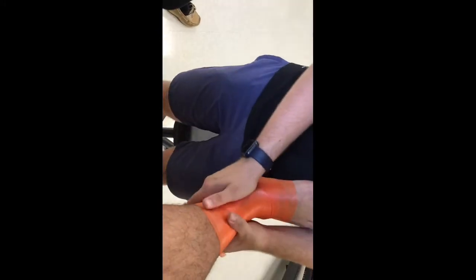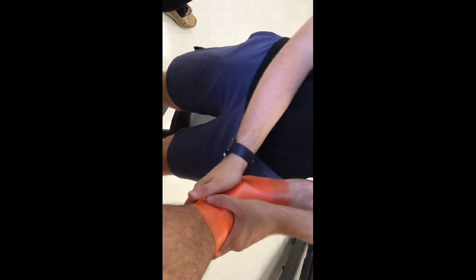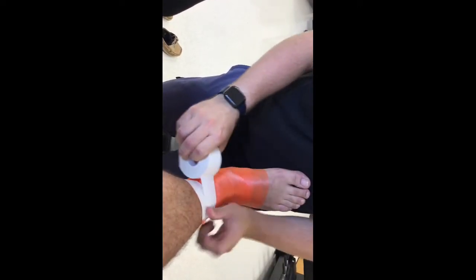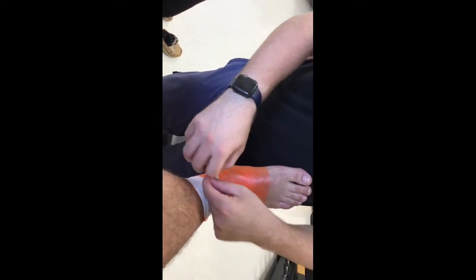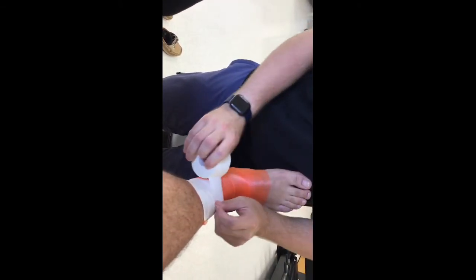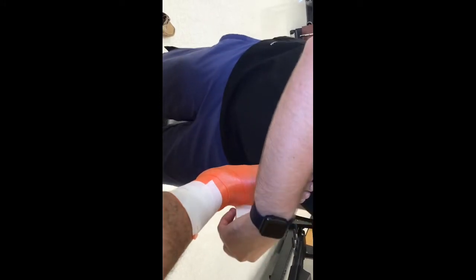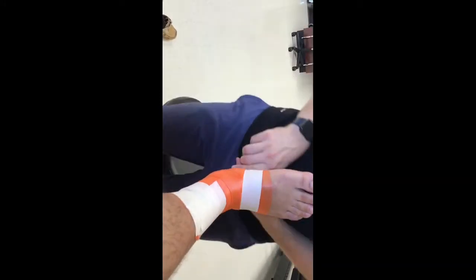Alright, see that? So the pad is right there on the medial side of the foot, and it is under the pre-wrap, so it's not going anywhere. We are gonna start out with our anchors. Got 1, 2, 3 anchors. Find the bone, do a midfoot anchor.